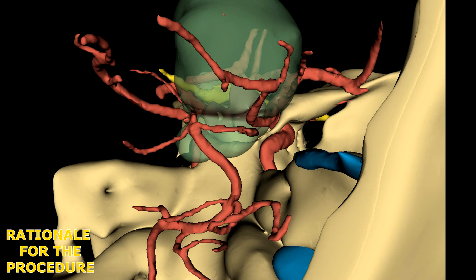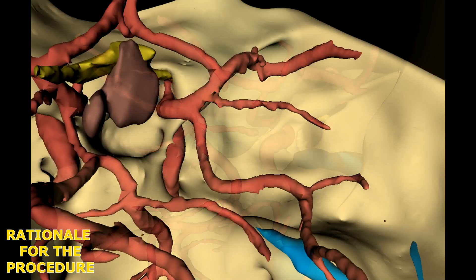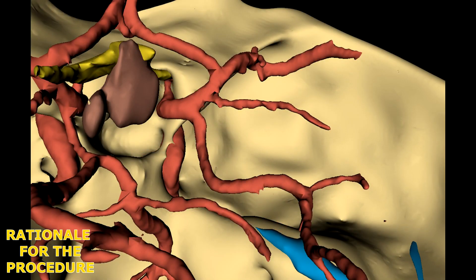This approach is presented as an alternative surgical option to be kept in the surgeon's armamentarium. Considering the side with the major projection of the mass and the absence of marked sigmoid sinus dominance, the right side was chosen. The posterior cerebral artery will be in evidence in the surgical field.